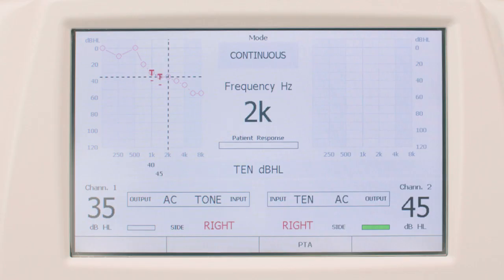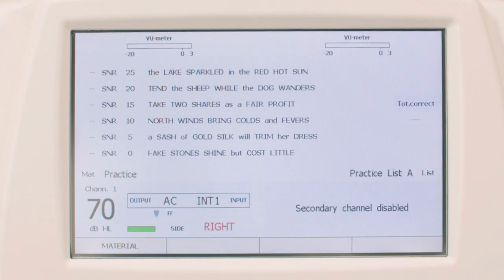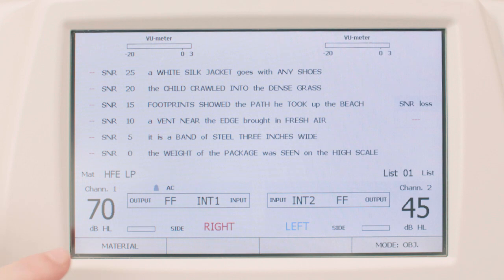Piano Basic also offers a two-channel master hearing aid and a dedicated screen for the TEN test, with a threshold equalizing noise already saved in the model's internal memory. The QuickSIN, available upon request, can be run directly from the Piano's dedicated screen without any need for an additional external player — all QuickSIN standard and split tracks are available.